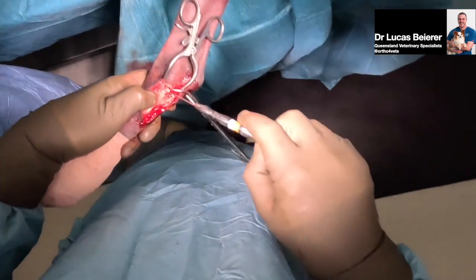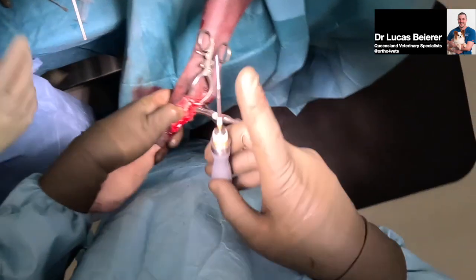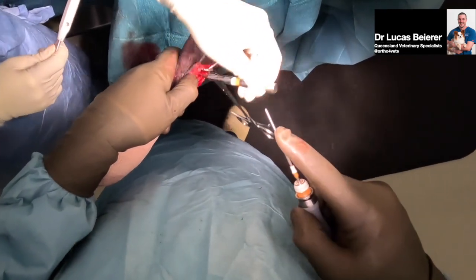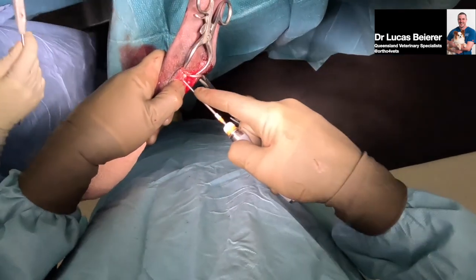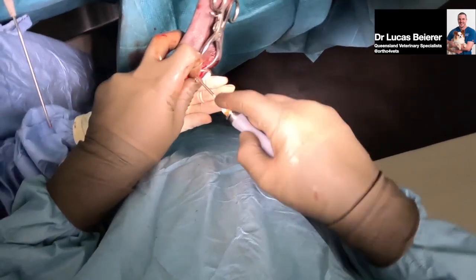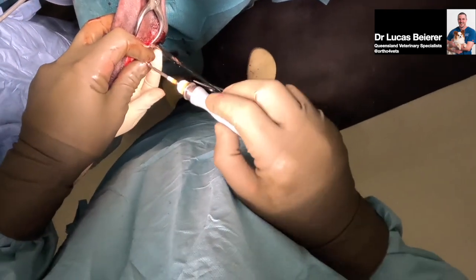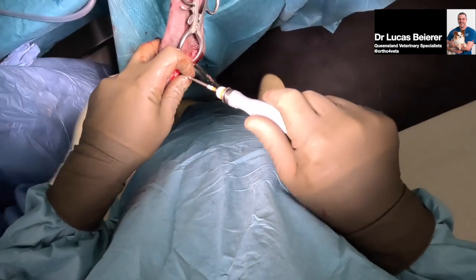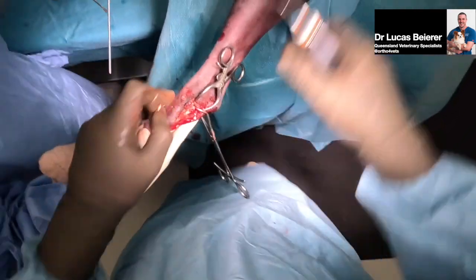Try and find that hole again. Take that out for me. Just gently give it a wiggle. Come back, yep. Good job. Some days are better than others. I don't even know if this is in the hole at this point. Can you support the leg? That might be a good way to do it.